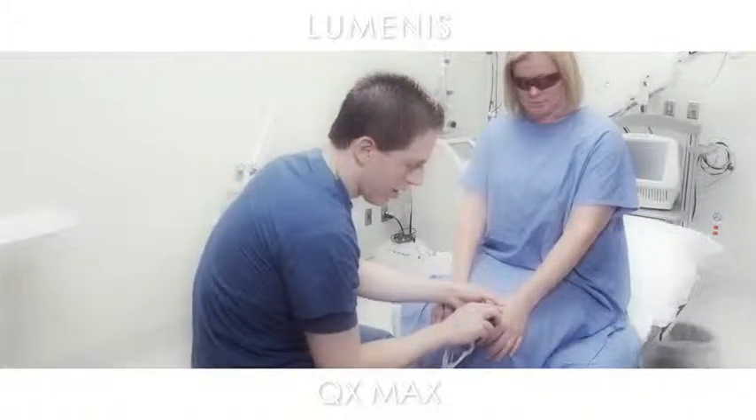One of the benefits of this laser is that you have five wavelengths at your disposal that can target multiple pigment colors as well as different skin types. You have the 1064 nanometer wavelength in Acceler mode that can target very dark colored pigments, such as dark blue, brown, blacks, and dark greens. You also have the 585 nanometer wavelength which can target orange or yellow, as well as the 532 nanometer wavelength which can target light colors such as yellow, white, or orange. The 650 nanometer wavelength would be excellent for blues or greens.